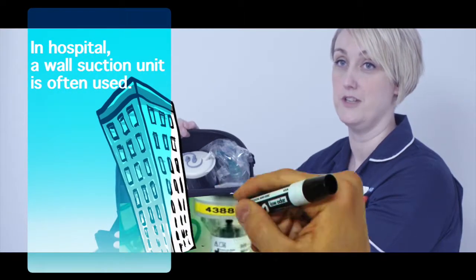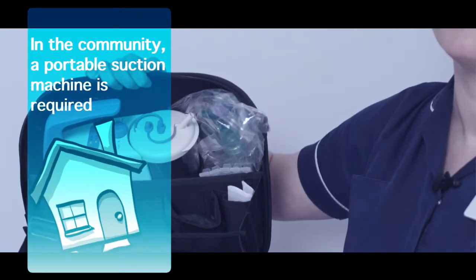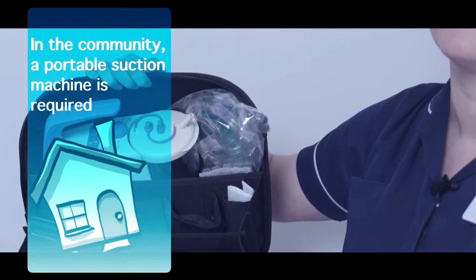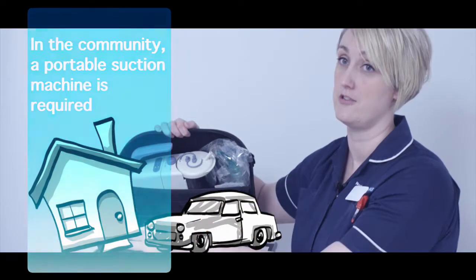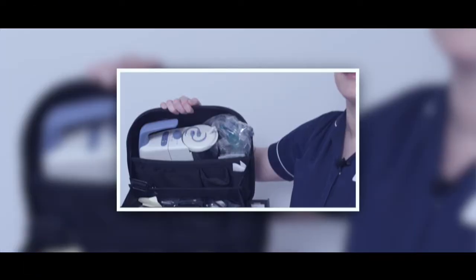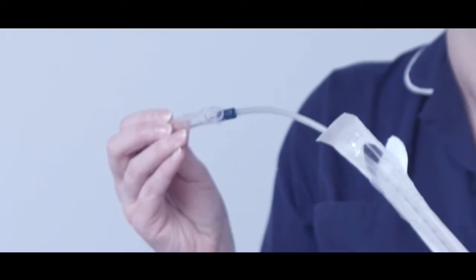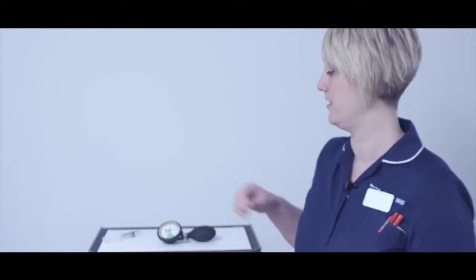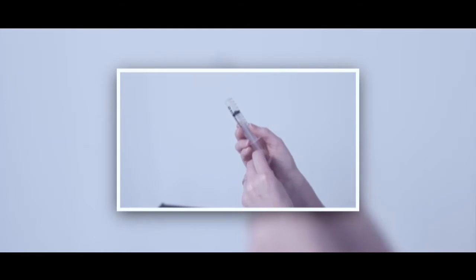In hospital a wall suction unit is often used. In the community, a portable suction machine is required, which can be both mains and battery operated so that it can be used on the go, and many come with an in-car charger. A suction machine is used for oral suction when attached to the Yankauer sucker, and for tracheal suction when attached to a suction catheter. For people with a cuffed tube, a cuff pressure manometer should be available, and supplies of 10ml syringes should also be on hand.